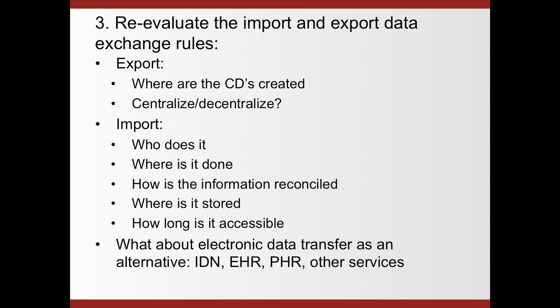And then again, think about exchange services. If you refer a lot of patients to, let's say, another larger institution, you might want to consider establishing a relationship with that institution and set up a VPN, virtual private network, and just exchange that information electronically. Instead of having to create a CD to be carried by a patient, replace the sneakerware with an electronic connection. Of course, you then need to make sure that this is, again, not only meeting all the requirements for privacy and security, but also that the way you exchange the information is done in a standard way. Otherwise, you are replacing the problem of not being able to read a CD with not being able to read the image that was received electronically.